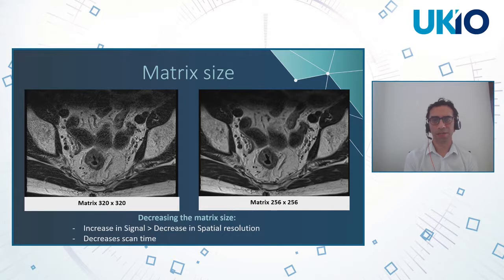So we find that a matrix size of 256 by 256 with a field of view of around 185 is a good compromise between these factors.